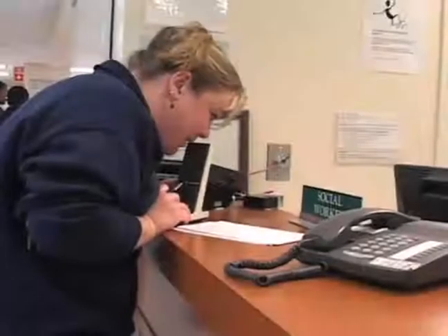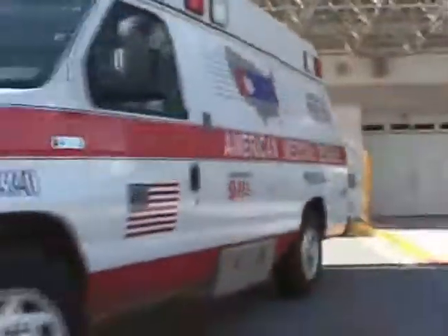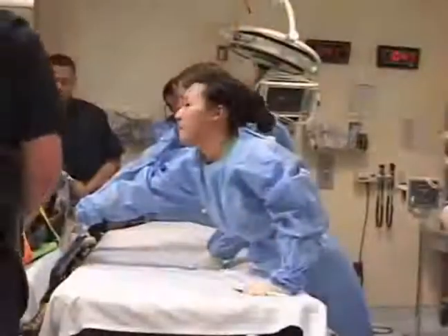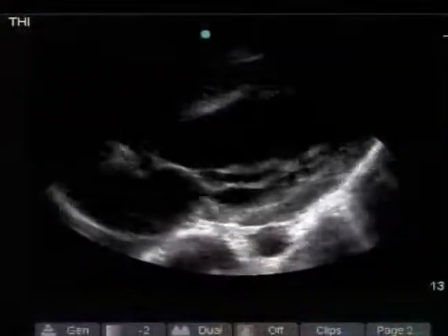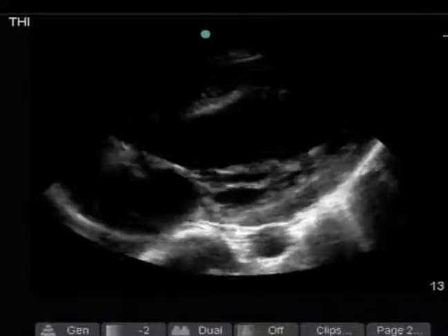A 68-year-old woman with a history of emphysema and hypertension presents to the emergency department with acute shortness of breath. She is hypertensive, tachypneic, and hypoxic. Chest auscultation reveals bilateral wheezes. Bronchodilation therapy is initiated and a chest x-ray is ordered. You perform a limited ED echo to search for alternative causes of this patient's dyspnea.